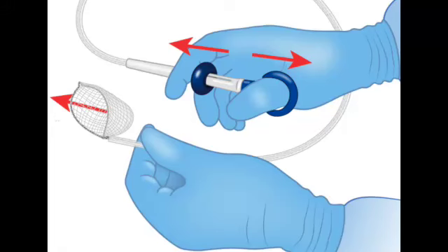Okay, imagine this scenario. An endoscopy, a really complex procedure, is done. The doctor's just snipped out a tiny bit of tissue, a polyp, right? And it could be the key to everything for the patient. But here's the real challenge, the kicker. It's that tiny sample. It needs to get out of the body, travel through all this tubing, and land in the lab perfectly preserved. It's like a logistical high wire act.